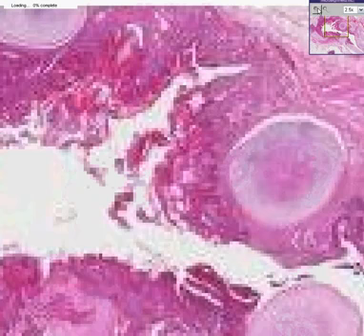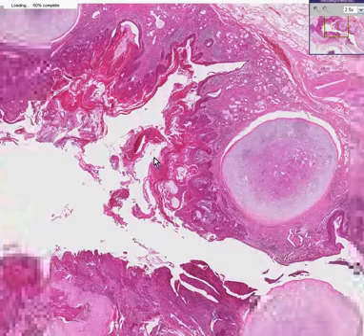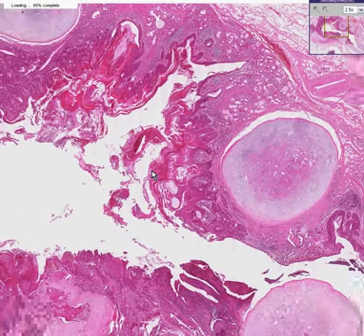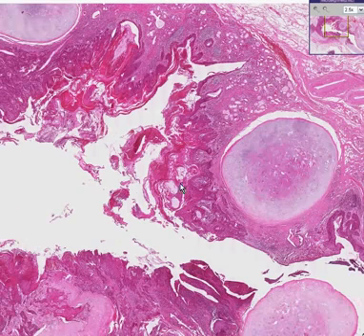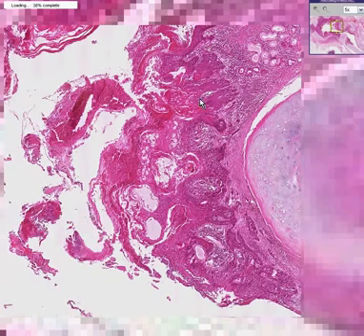If the tumor makes clearly defined, nice, visible pearls, which are little squamous nests, and they look like the little nest that you see in seborrheic keratosis, they're called pearls. You can call this well differentiated. I think I could convince you that there's a little pearl here.